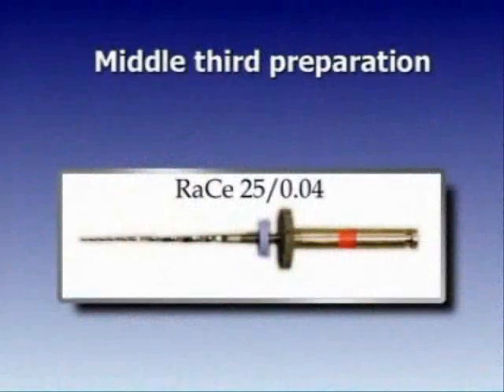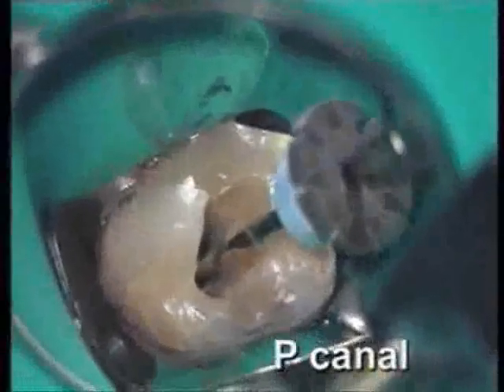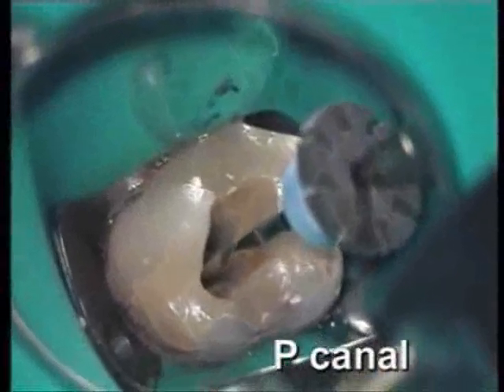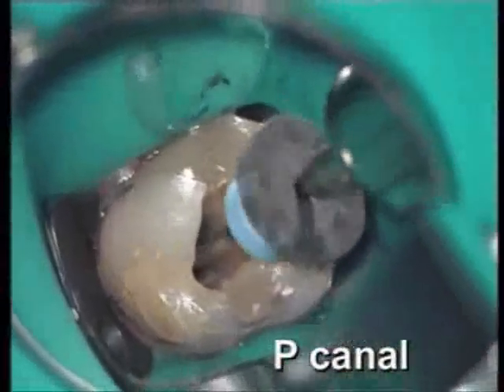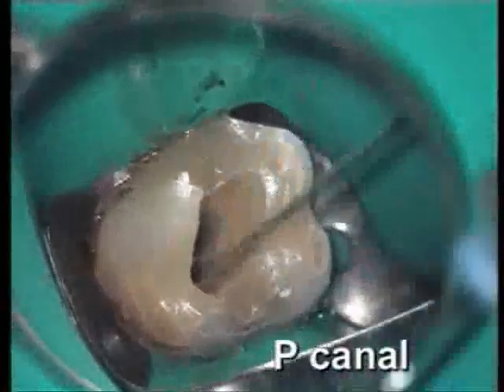Change to RACE 25, 04 taper. Palatal canal, then the disto-buccal canal.